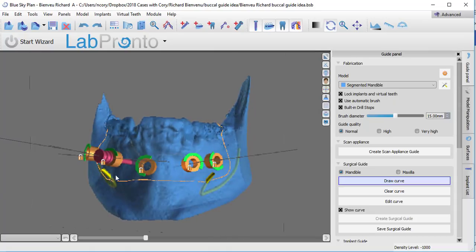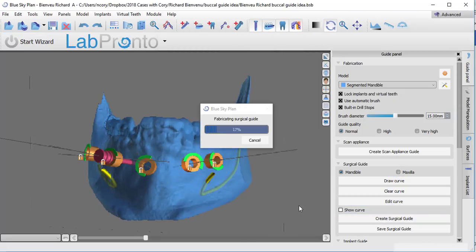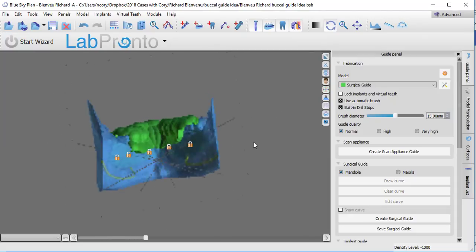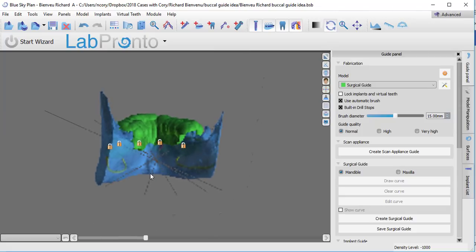Okay, so make sure that your guide line comes below the guide tubes. Now we can edit this curve, and then let's create the surgical guide. Okay, here you see the resulting surgical guide. Again, all the undercuts have been removed. It's a huge, big, bulky thing right now, but that's okay. We're going to overcome that in the next step.